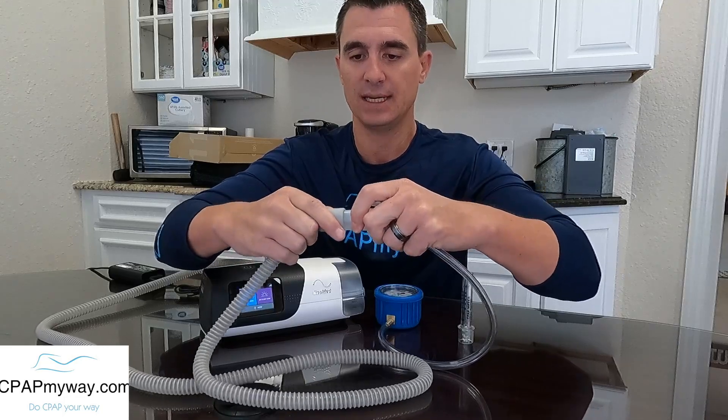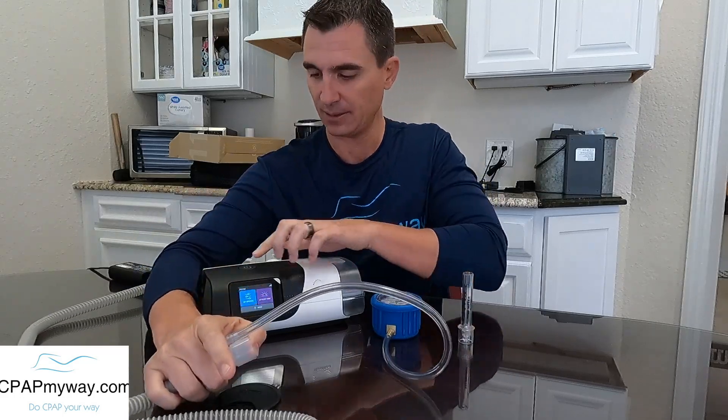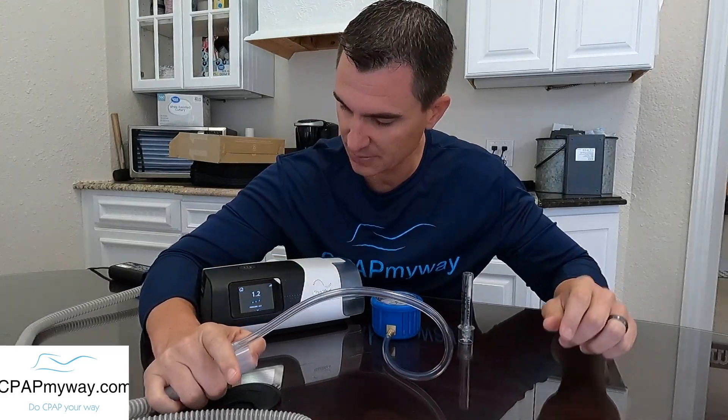This is an AirSense 11. I've got it set at 10 centimeters of pressure and I'm going to show you how to check if this machine is blowing at the correct pressure on both types of manometers. To use the professional manometer, you hook up this little bleed adapter, cover the outlet, and then crank up your CPAP.